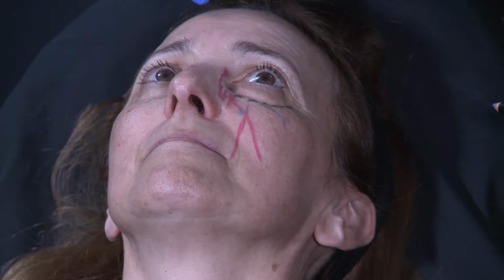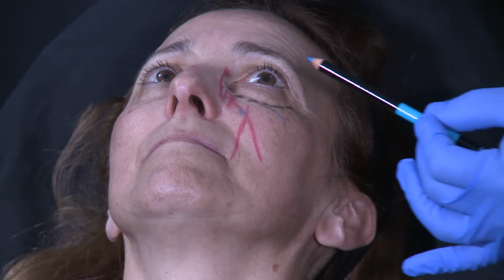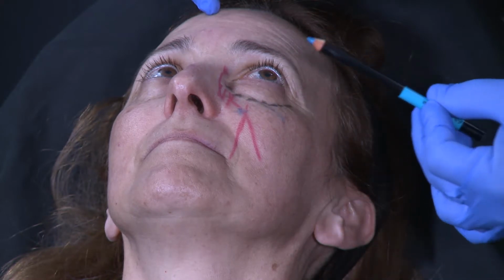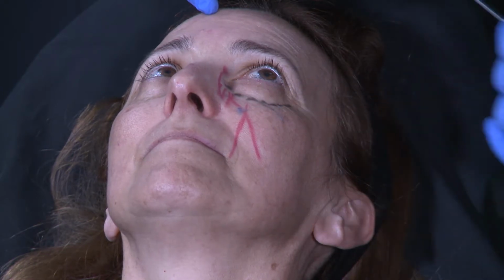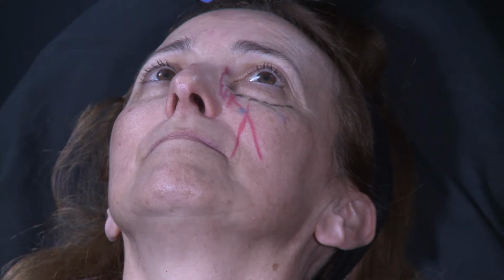And I want also my cannula to be rigid, just to know where I'm going and where is the tip of my cannula. I want to feel the tip of my cannula. So it means that for this area, I will use a 25 gauge cannula that is rigid enough, so I will know when I push my syringe where will go my cannula, because it will be straight with my syringe. So here I will use a 50 millimeters length cannula and a 25 gauge. And after, will I be superficial or will I be deep?